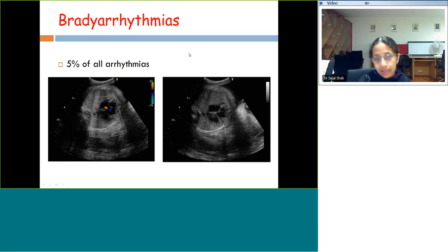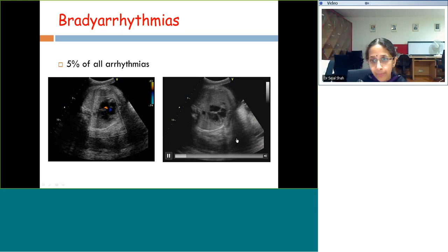Now coming to the second type of arrhythmias, which is bradyarrhythmias. The bradyarrhythmias are much less common than tachyarrhythmias. They account for only 5% of all arrhythmias. And how do they look on 2D? So this is how subjectively we can see. In this video we can see that just grossly we can understand that the heart rates are very low.